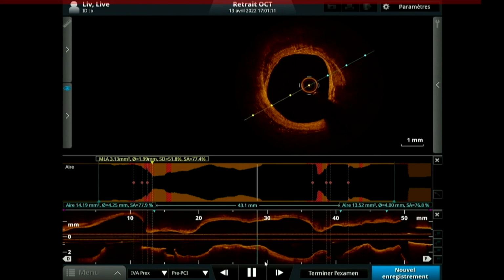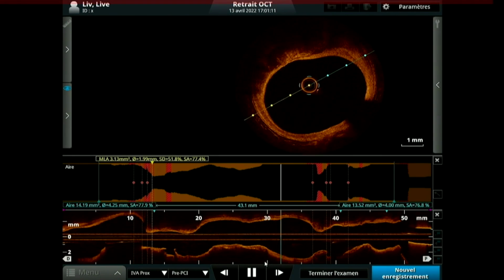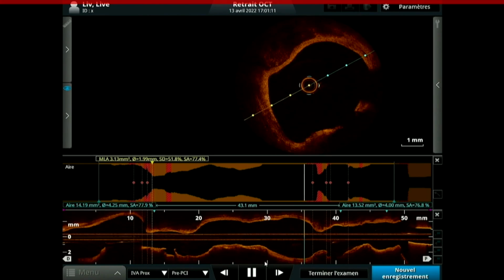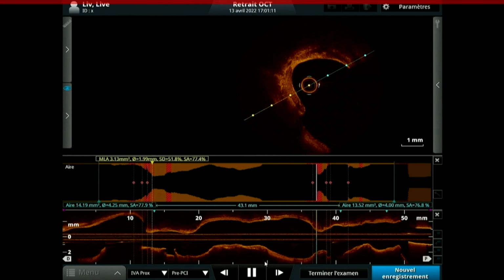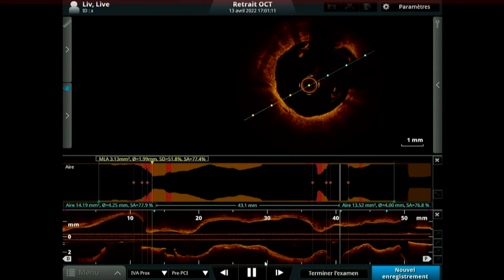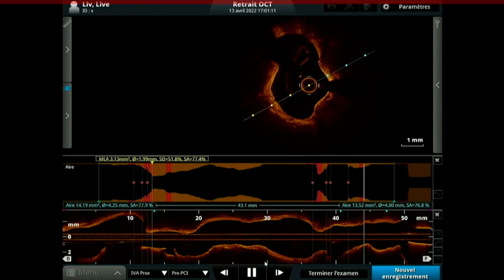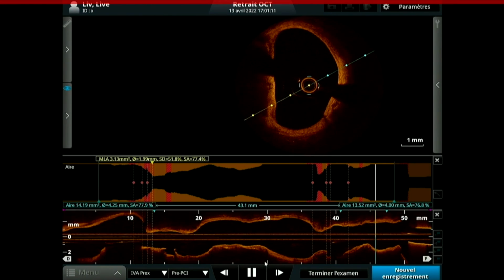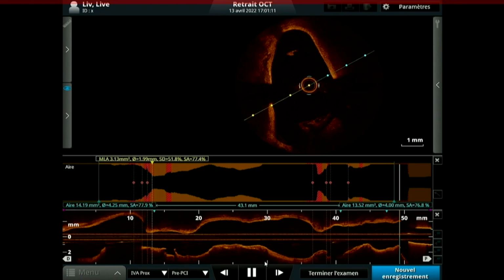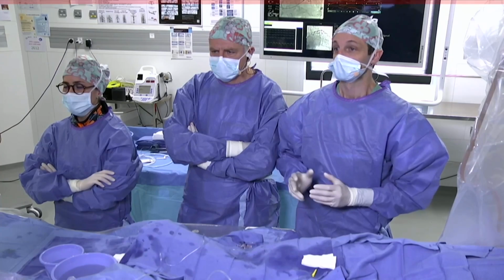And as you said, Bruno, in the angiogram, when we go to the ostial LAD, you can see this aneurysmal dilatation just after a very tight and massively calcified stenosis of the left main. When we pull back to the mid left main and the proximal left main, you can see again this tubular calcification with ellipticity of the vessel, which makes the treatment and the preparation of the plaques definitely essential.